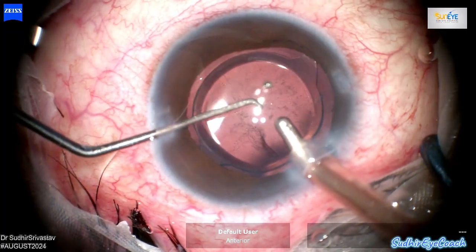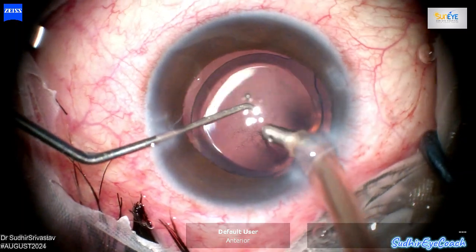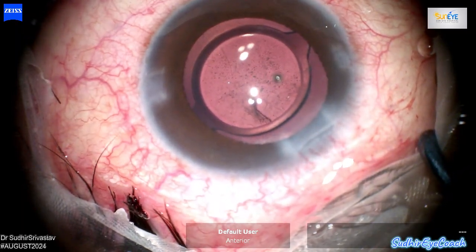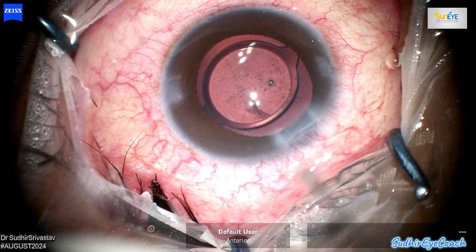Although we can see some deposits visible in the entire vitreous cavity, these will be evaluated during the post-operative period. A thorough retinal checkup is necessary to detect any potential retinal tears and to conduct a detailed retinal analysis.